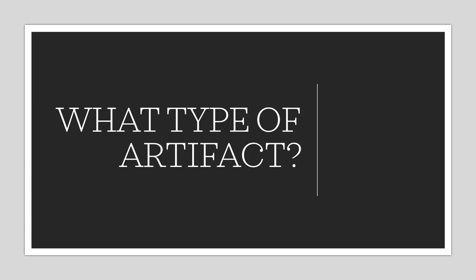What type of artifact? This is an equipment artifact. The IR is backwards.